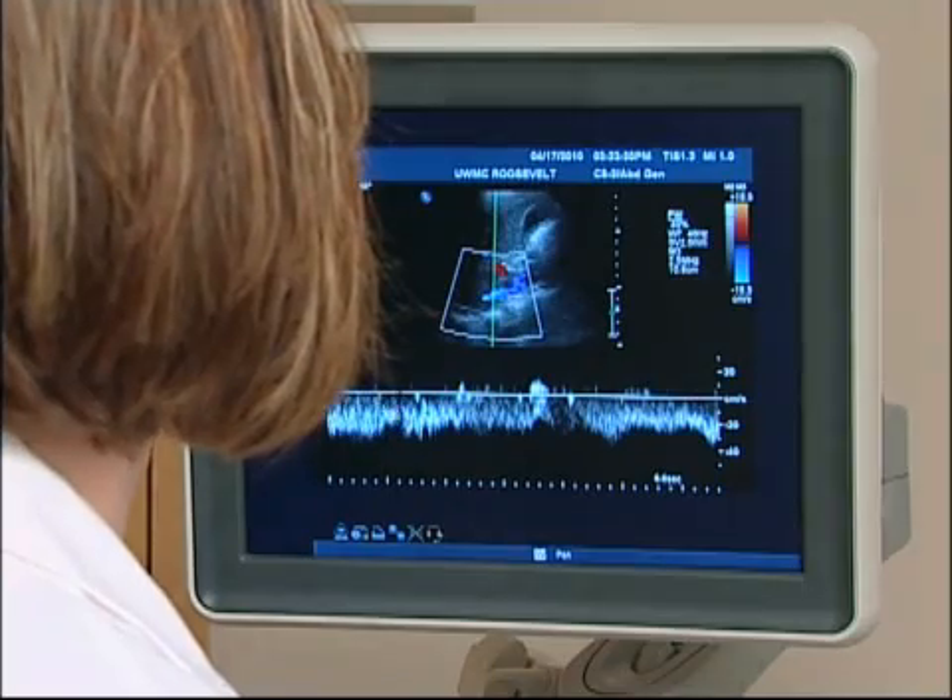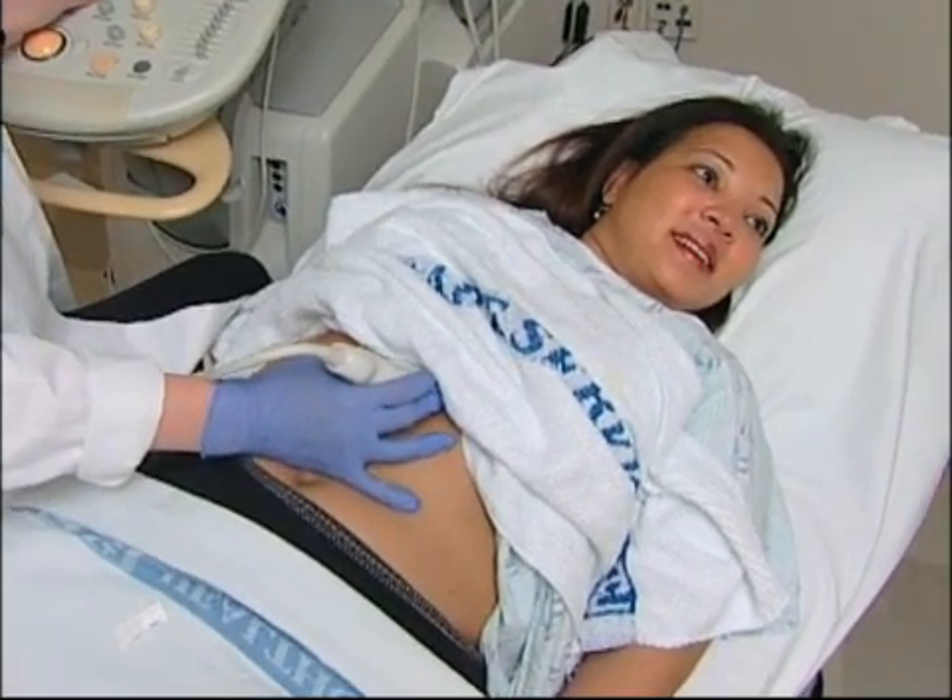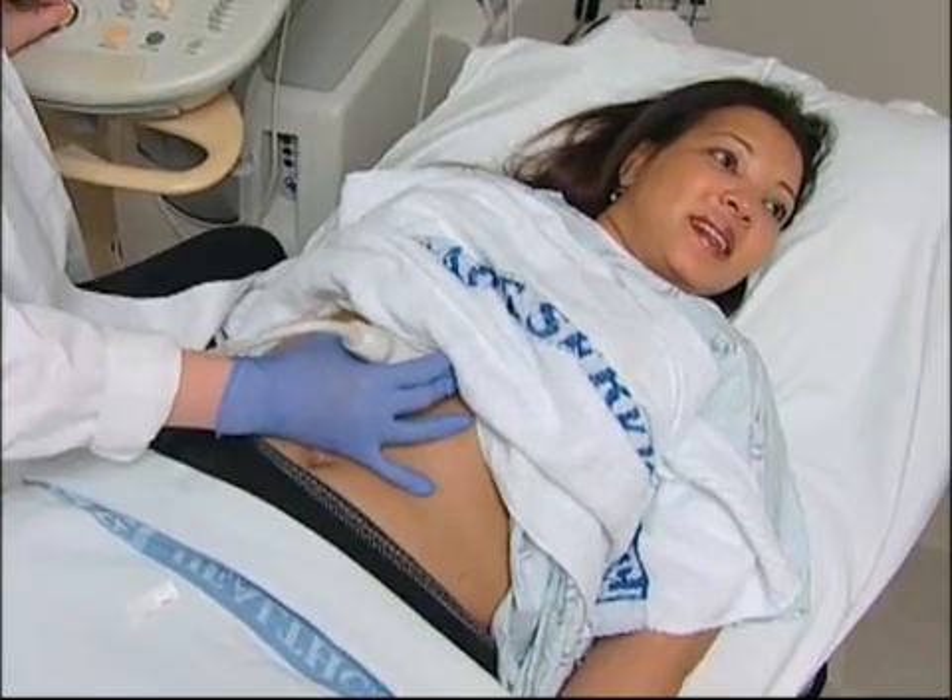If Doppler ultrasound is performed, you may hear pulse-like sounds that change in pitch as the blood flow is monitored and measured.